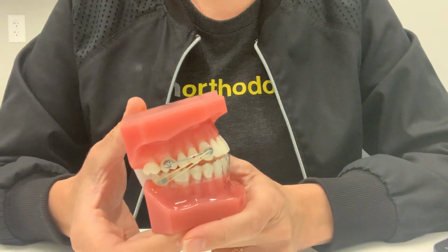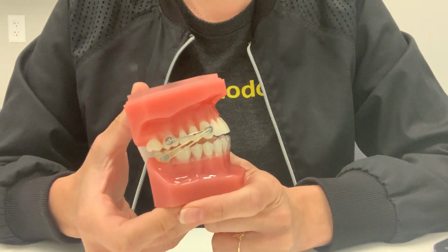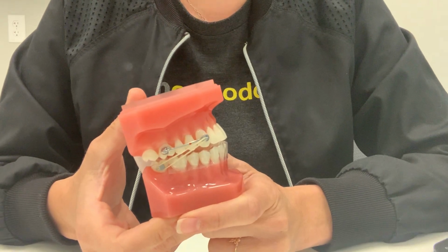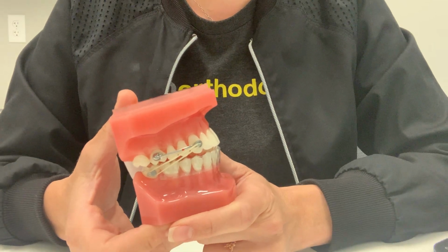The rubber bands are to be worn all day and all night. The only time you take them out is when you are eating or brushing your teeth. When you're done eating or brushing, you should put new rubber bands on. This way you're changing the rubber bands about 3 to 4 times a day.